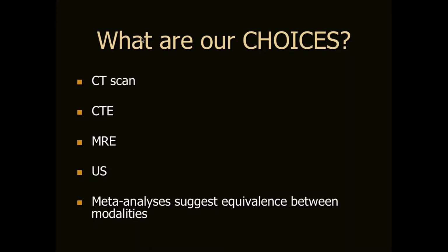MR enterography is fortunately very available to me in my facility, and although I recommend it routinely, I don't recommend it frequently. And ultrasound, of course, we do multiple patients daily, both routine elective patients, inpatients, and emergency patients as well. And meta-analyses suggest that there's general equivalence between all of these modalities.